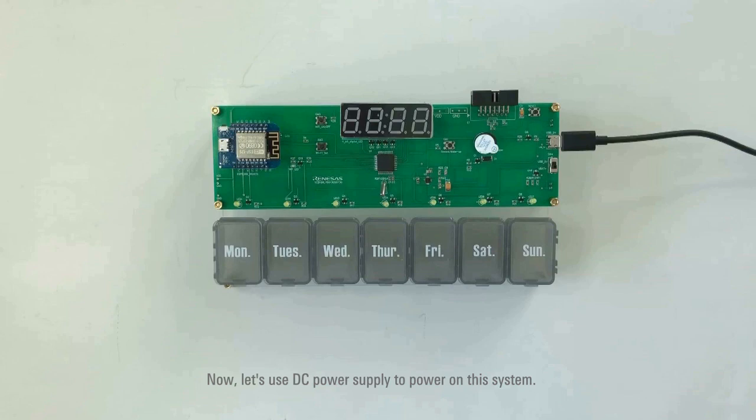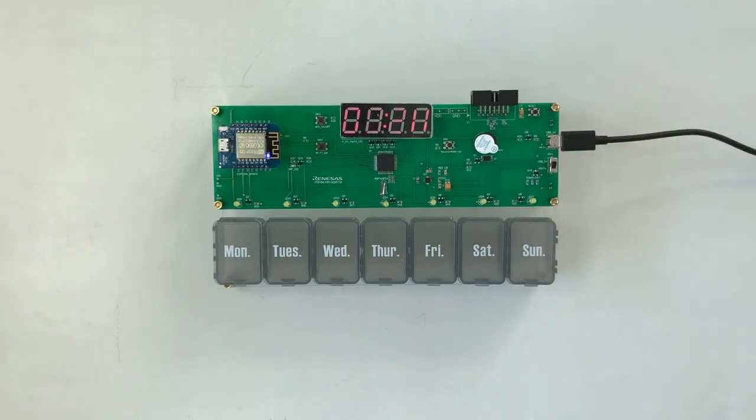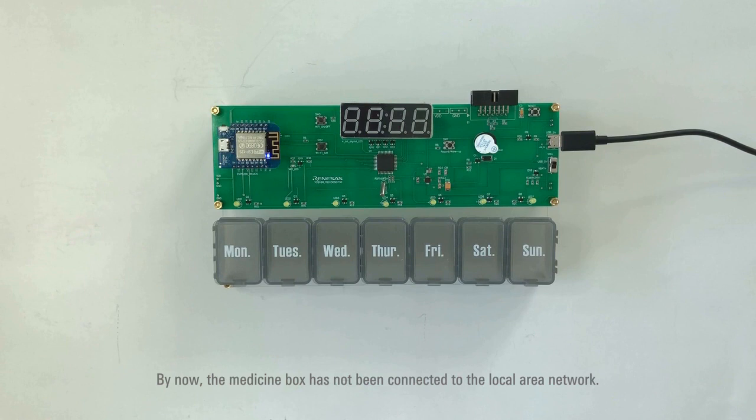Now let's use DC power supply to power on the system. Once the system is powered on, the preset time will be displayed on the 4-digit 7-segment LED, and the LED indicator for the Wi-Fi module will blink every 4 seconds. By now, the medicine box has not been connected to the local area network.